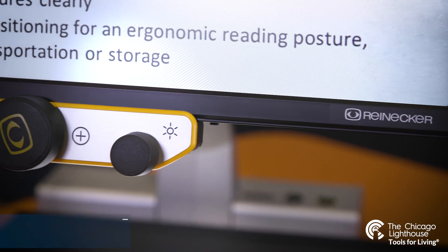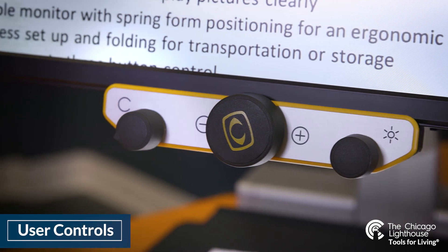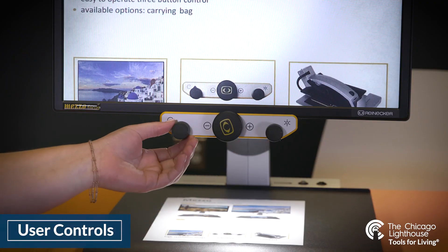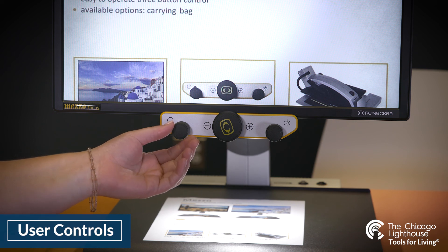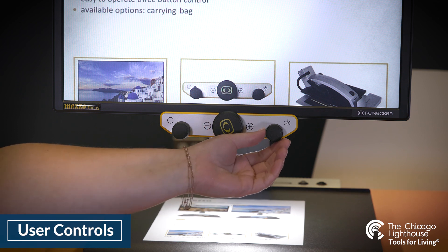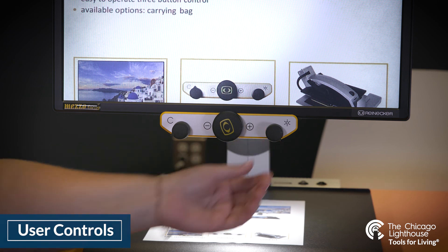Next we can move to the front controls of the Mezzo. We have three dials that we can press. On the left we have our color mode selection, in the middle you have your magnification and overview, and on the right you have your brightness and contrast dial, which will also give a selection for reading lines.